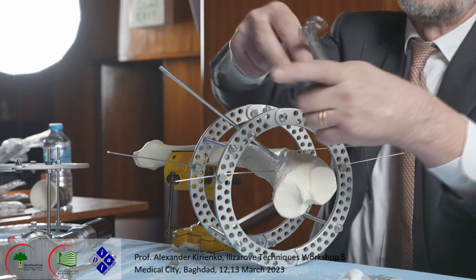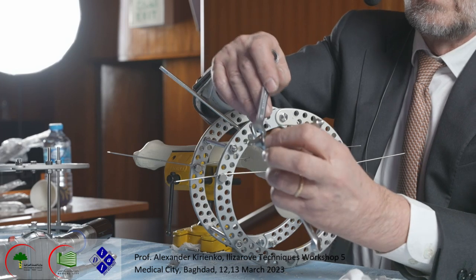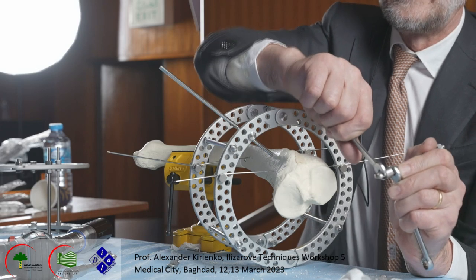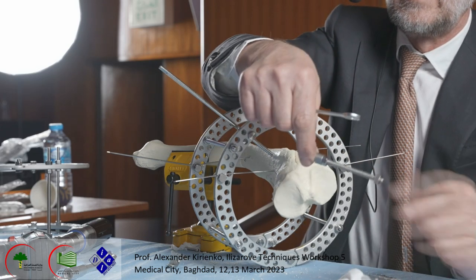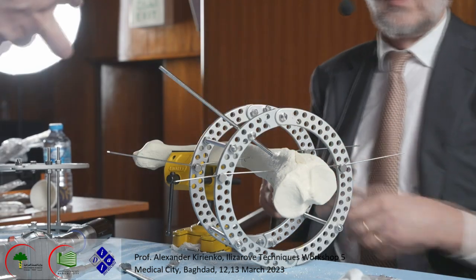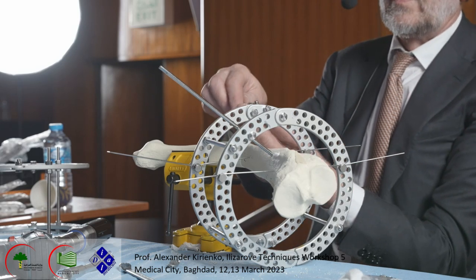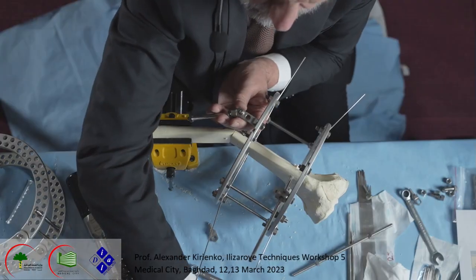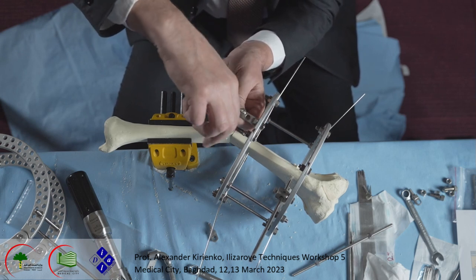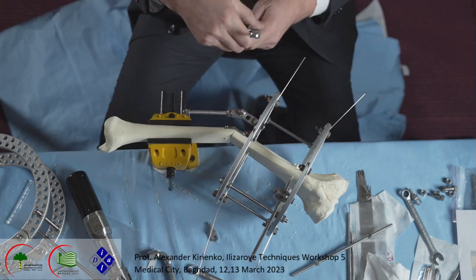We'll touch it this way. Okay, we build this. What we do now, we put it here, like this. Another one we put posteriorly.